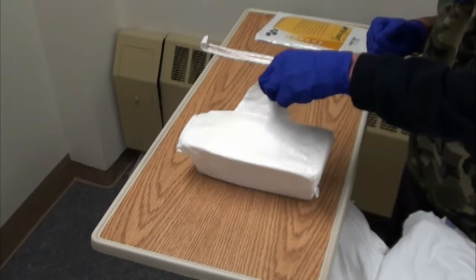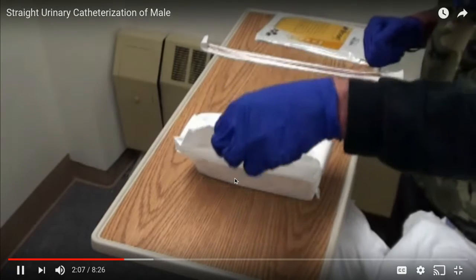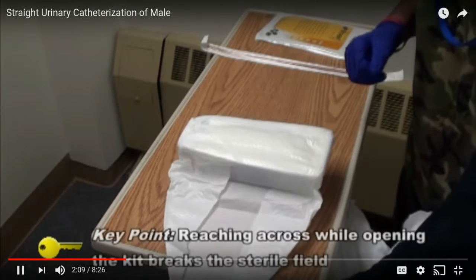Grabbing only the ends. Now, you will see here how he maintains his sterile field. He does have on gloves. Those gloves are not sterile, but if you watch the way he opens it, he is very careful to open it to maintain his sterile field at all times. We will practice this sterile technique as well. Open up my catheter kit.